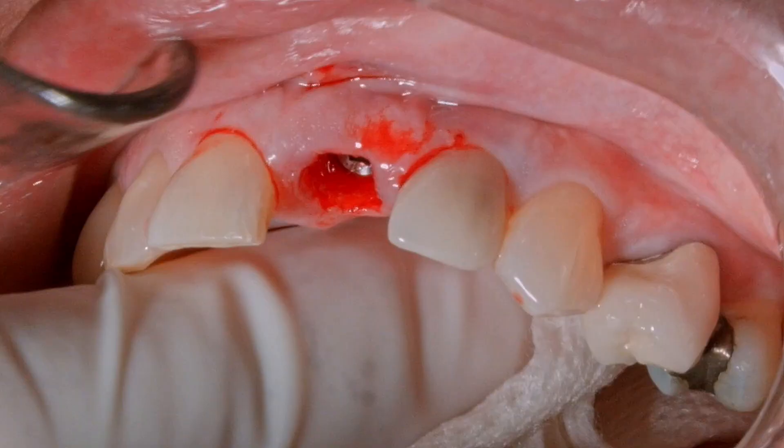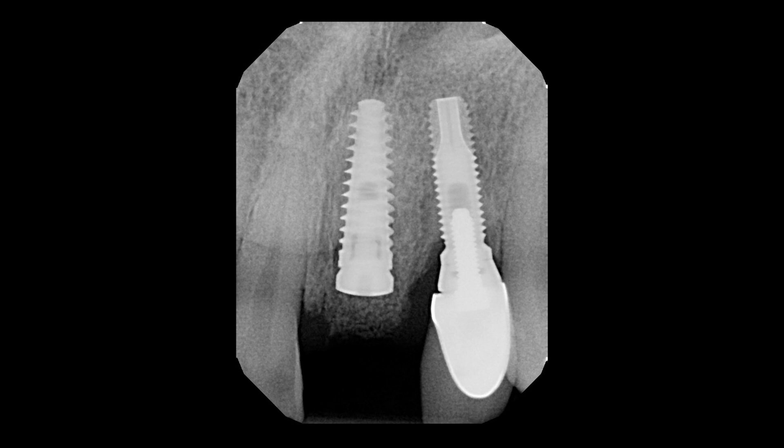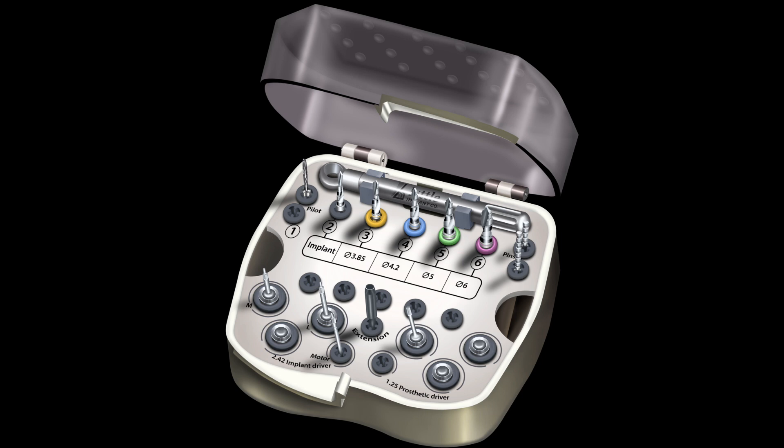You can see when we look at the surgical kit that we have a highly simplified kit compared to most dental implant armamentariums. Here you can see the multi-drill technology which allows for improved implant site preparation.